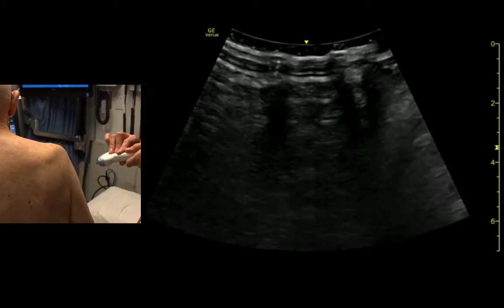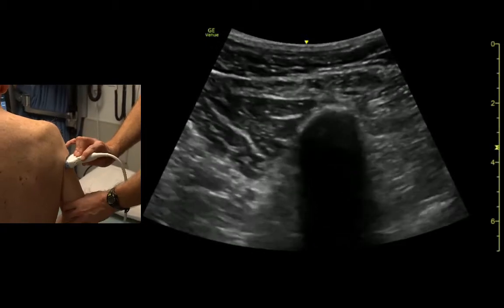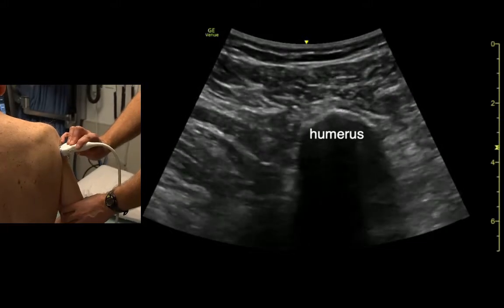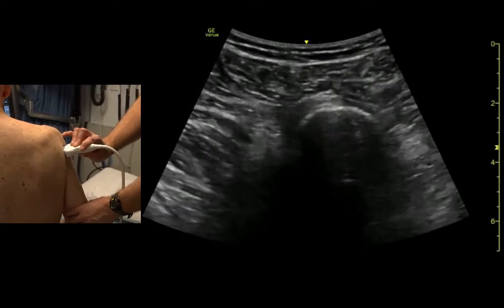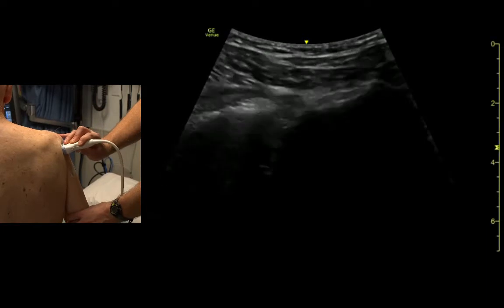I like the curved probe just because it gives us a nice wide view of this joint — it's a wide space. Come down kind of low on the humerus and identify that. If we just follow it towards the patient's head, you'll see the humeral head start to get wider and more superficial, and you'll get right up to where you hit the joint space itself.